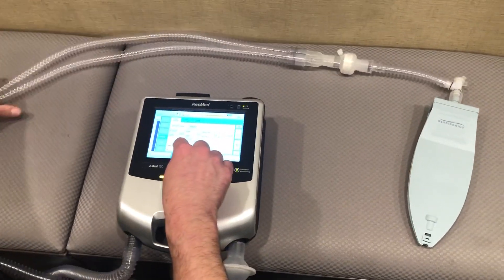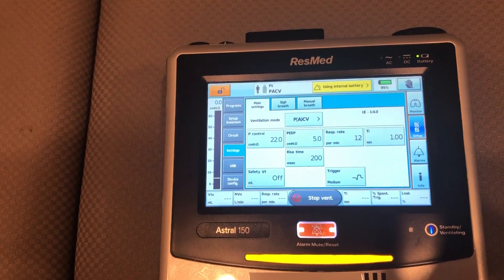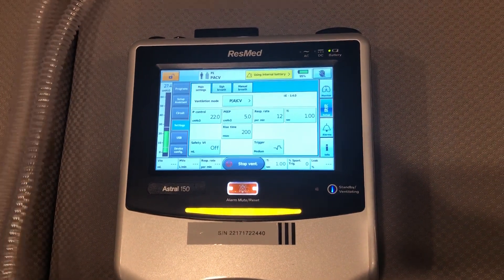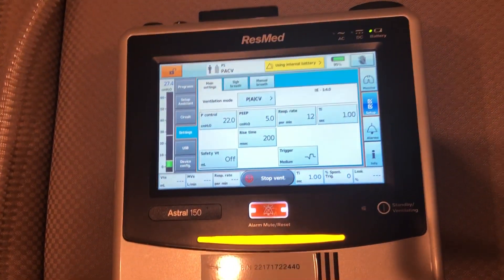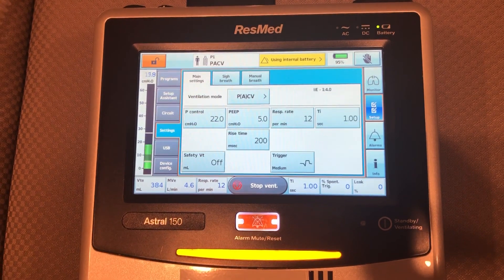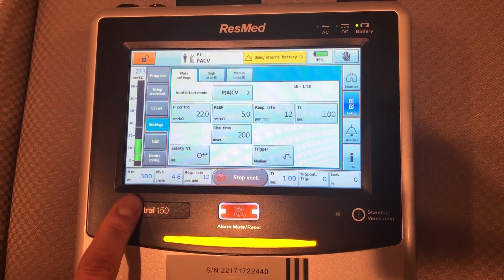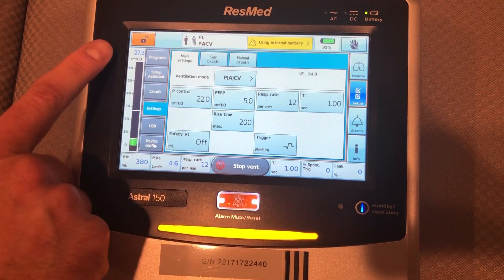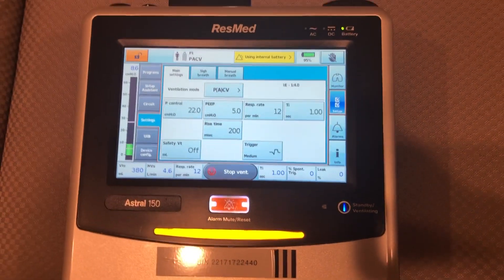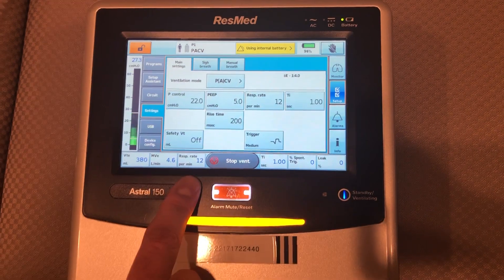Now I'm going to turn the vent on by applying the settings and then starting the vent. You'll notice at the bottom of the screen we have our patient values — our exhaled tidal volume. We're currently getting a tidal volume of close to 400. We're using a pressure of around 27 currently. Our exhaled minute volume is 4.6 and our respiratory rate is 12.